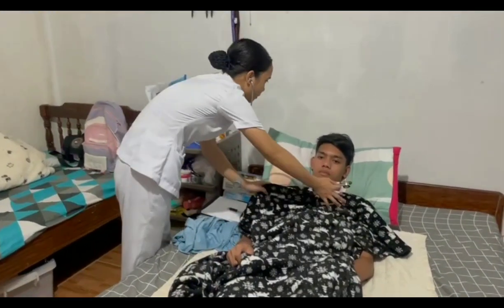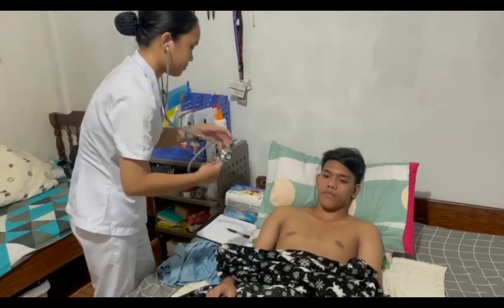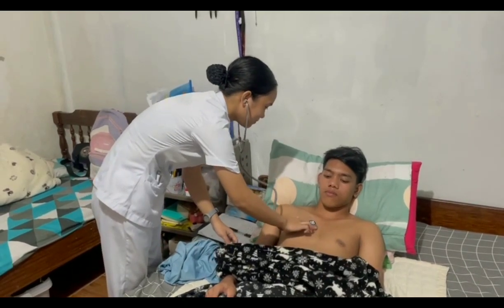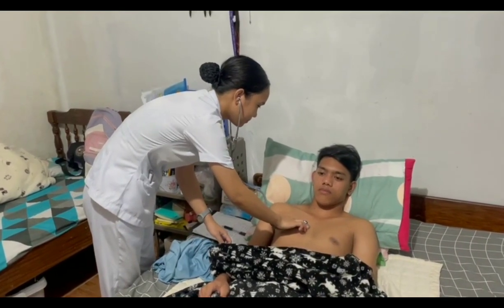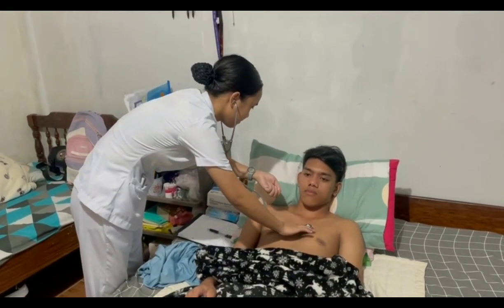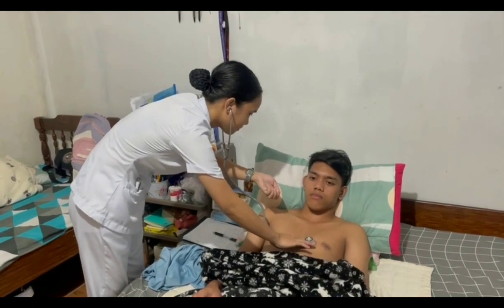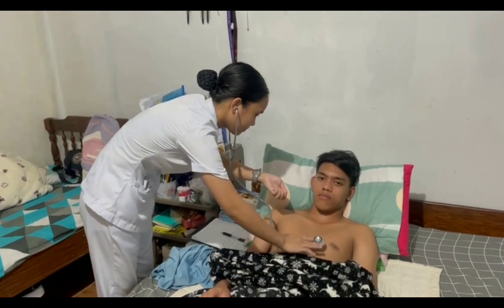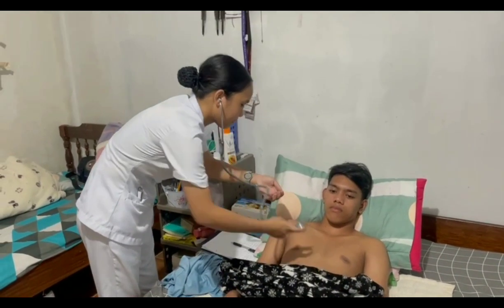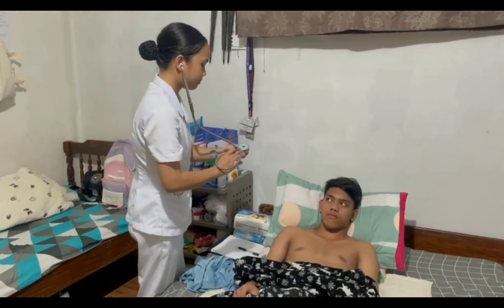Okay, sir, kindly breathe regularly while I am scoping, sir. Now, I'm gonna use the bell.